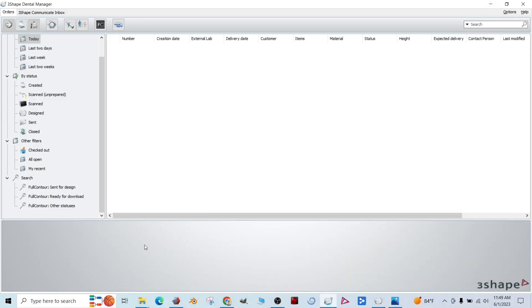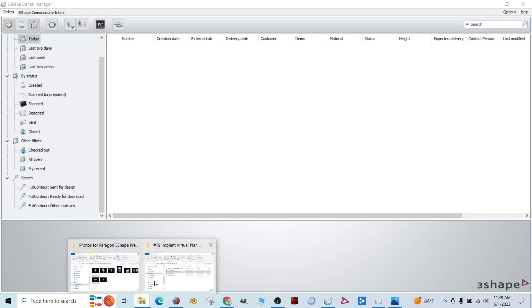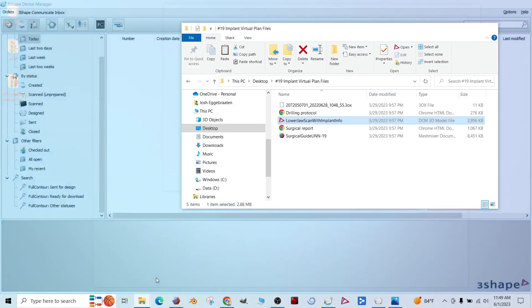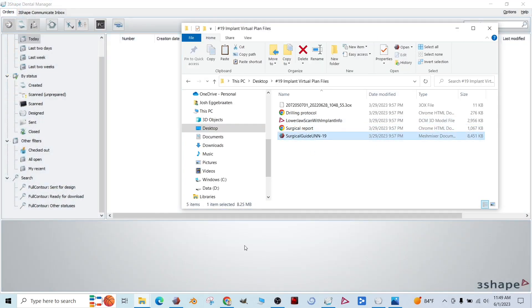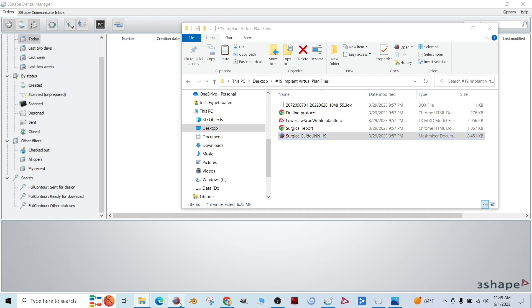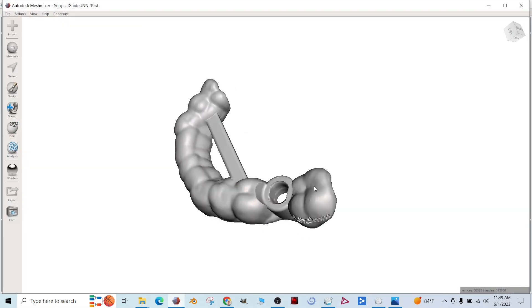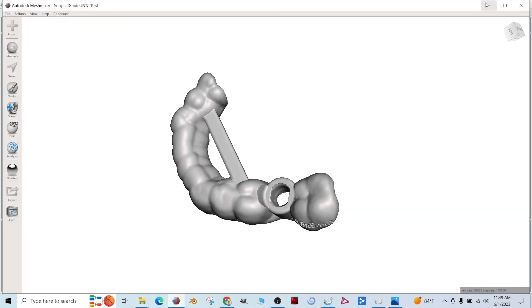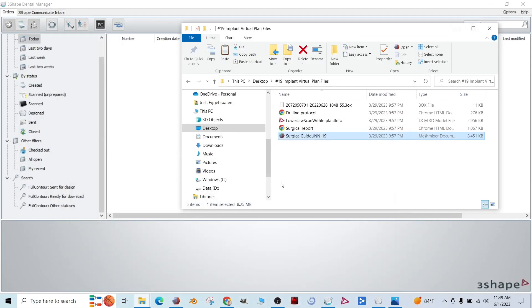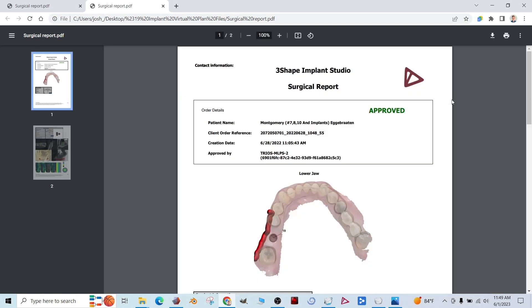So when we're doing the virtual implant plan, we get these files at the end of it. In this case, it's a guided implant placement. So we have our surgical guide and our surgical report.